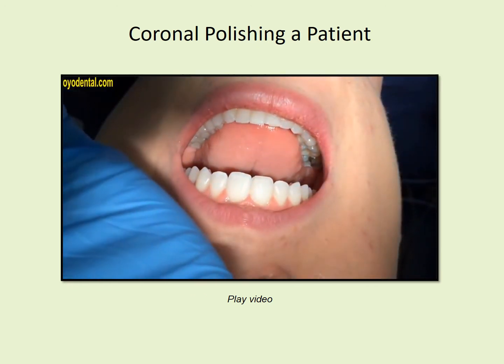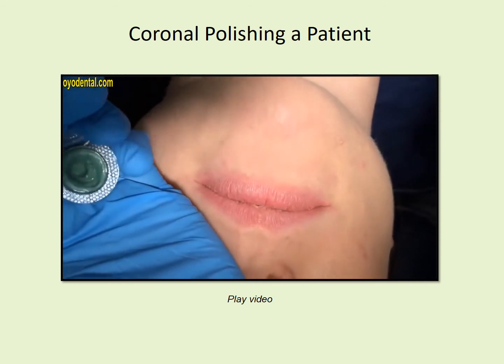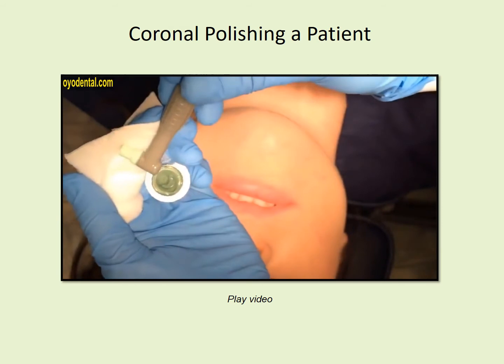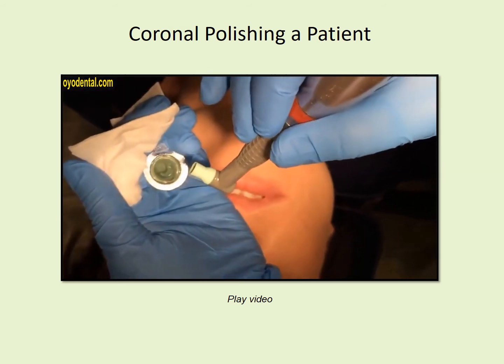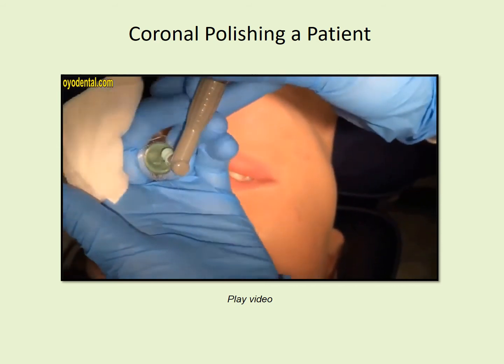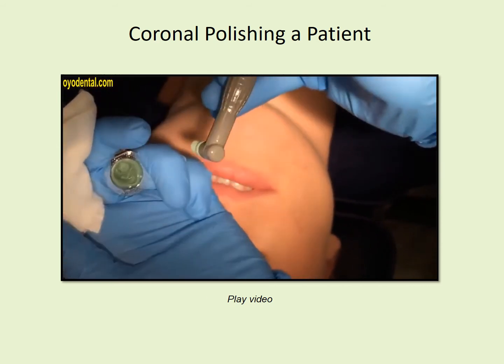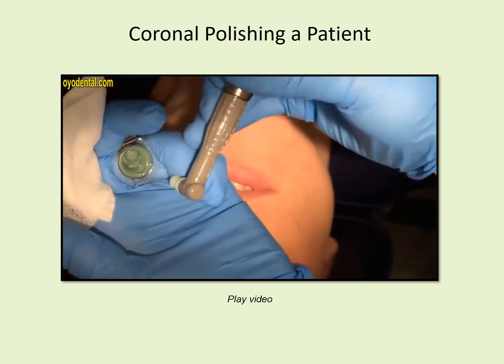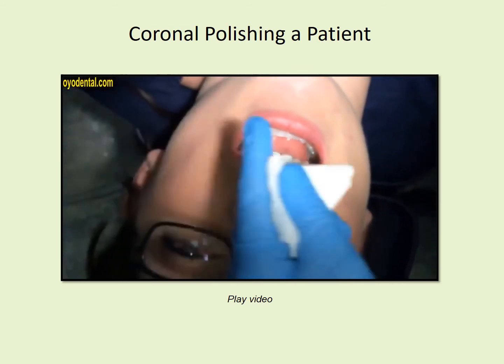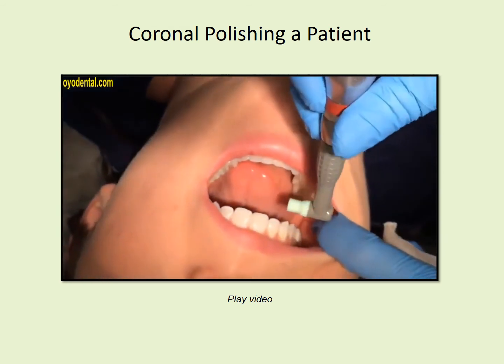I actually hold the prophy paste in my hand like so, with some 2x2 gauze right here to wipe excess saliva. So my prophy paste is between those 2 fingers. I hold like this, and I can come in and grab. So I keep these 2 fingers tucked so they're not in the way. And I also take my thumb, pinch it like this, so I can use this finger as retraction.